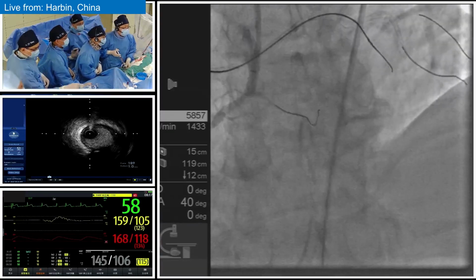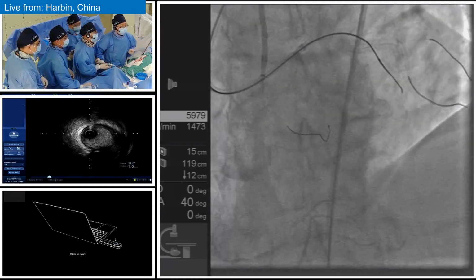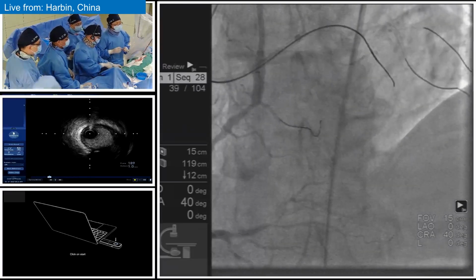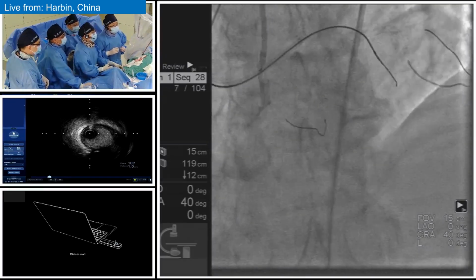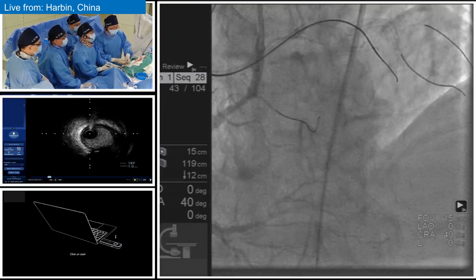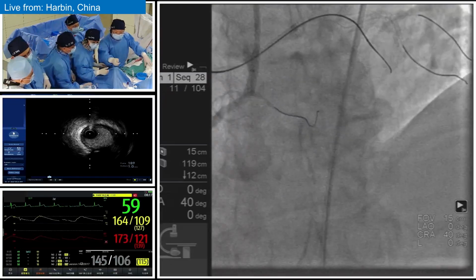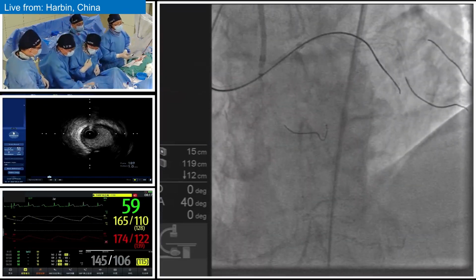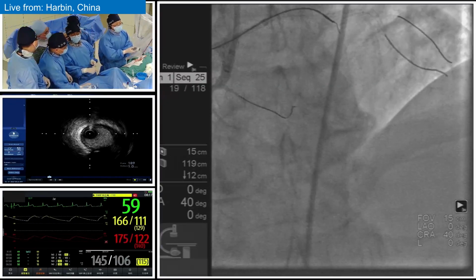However, this dual lumen microcatheter failed to guide the antegrade wire into the true lumen, because we found from the CTO reconstruction information and the bilateral angiography that there is a very big proximal entry point, and also some calcification, which raise the difficulty of antegrade wire escalation. Since then, we noticed that there are several questions involved in the antegrade approach.